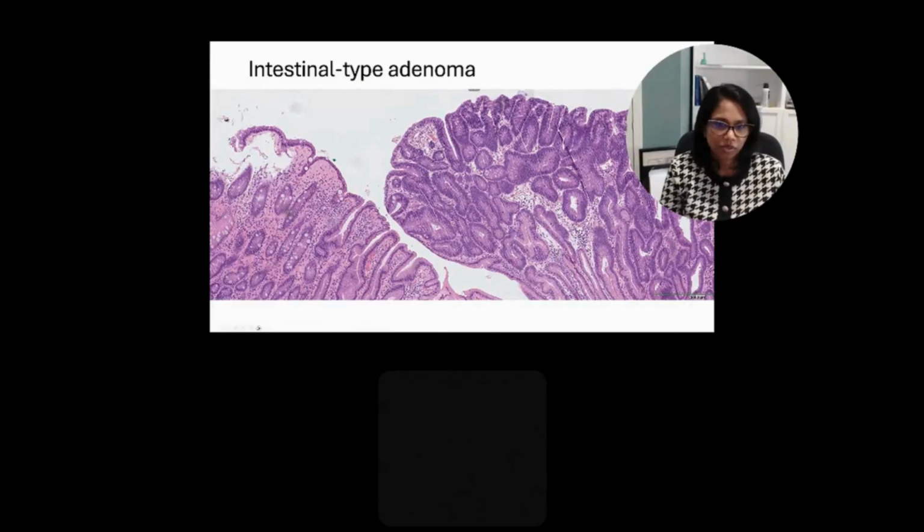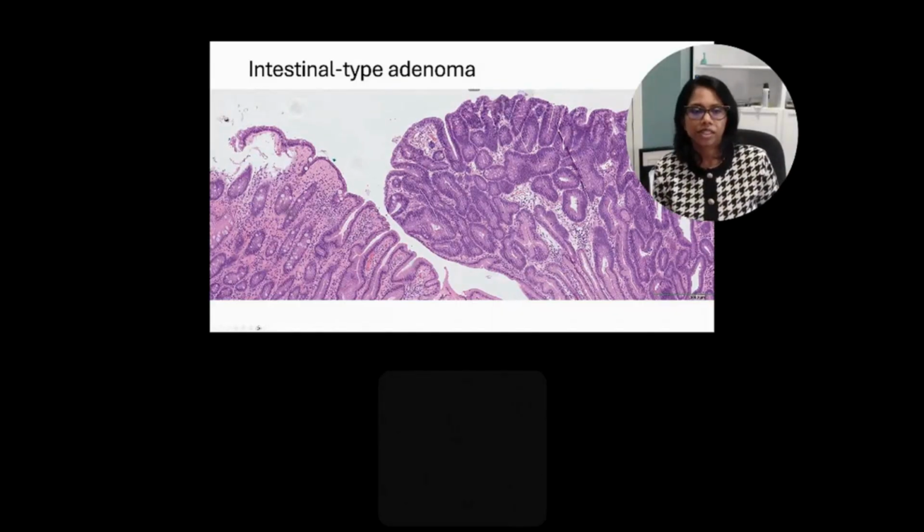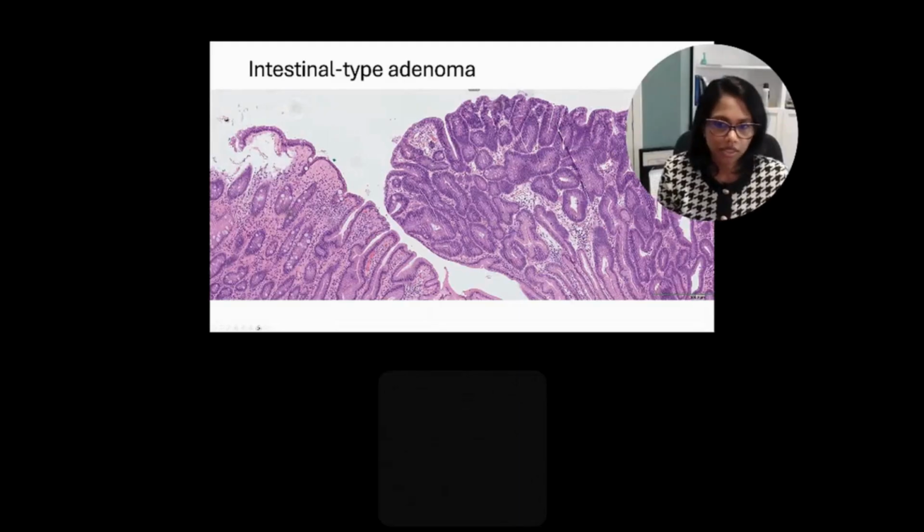And here you have your typical low-grade adenomatous dysplasia with picket fencing, penicillate nuclei in a neat, tidy basal row with minimal stratification. So this is still very much low-grade and quite organized. High-grade dysplasia would be akin to what you see elsewhere, but this would be intestinal type adenoma with low-grade dysplasia, negative for high-grade dysplasia.